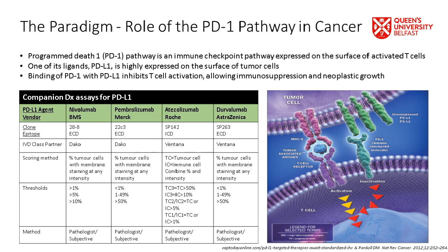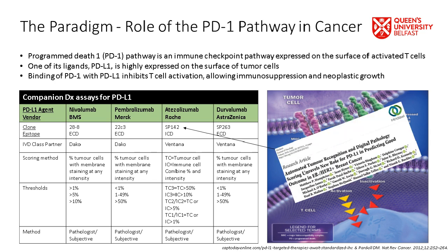In fact, PD-L1 SP142 has just been accepted as a clone of choice for the diagnostic test in triple-negative breast cancer, among others. And this scoring method is slightly different to the rest, which do talk a similar language in terms of tumor cell-only expression. So we published a paper back in 2018 on this and identified a new role for PD-L1 predicting good outcome in HER2-positive ER-negative breast cancer. I'd encourage you to check that out as well. But the one thing that these diagnostic assays do have in common is the need for the subjective pathologist assessment.